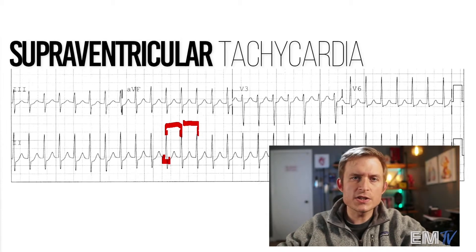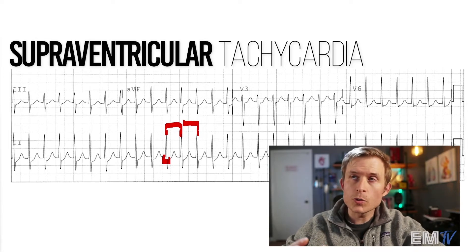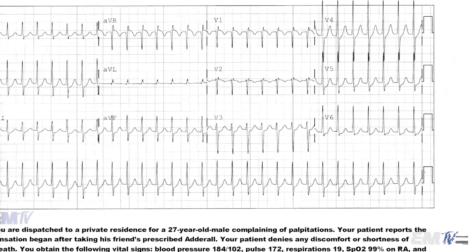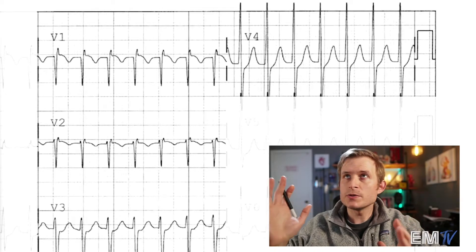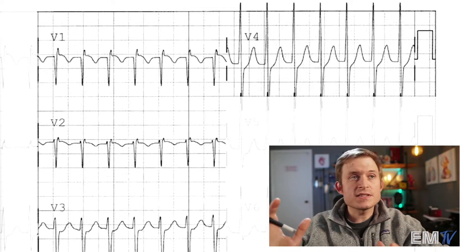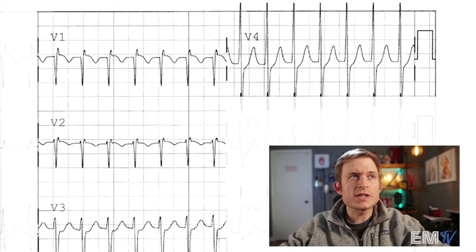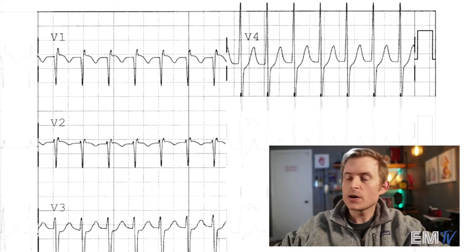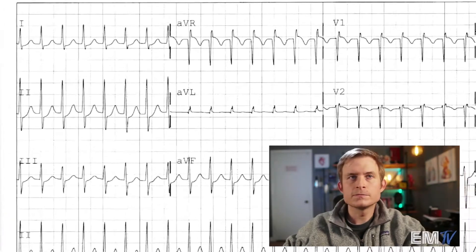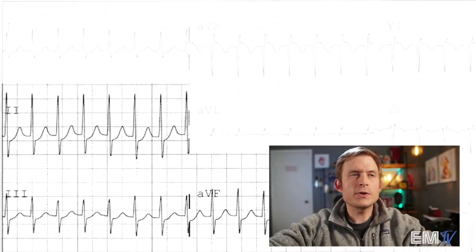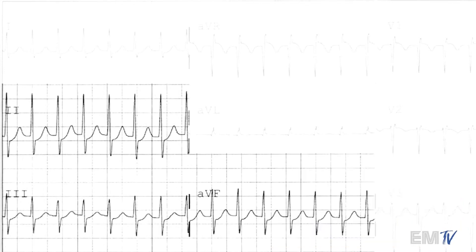Let's now take a look at each individual lead grouping to see if we can find anything more malignant or anything more wrong with this rhythm. In examining the anterior leads — this is where I prefer to start — V1 through V4, I'm not seeing any ST segment elevation. I am, however, seeing ST depression in V3 and V4. In my inferior leads, which are 2, 3, and AVF, I'm not seeing any ST segment elevation, but I'm seeing, once again, ST segment depression in all of those leads.